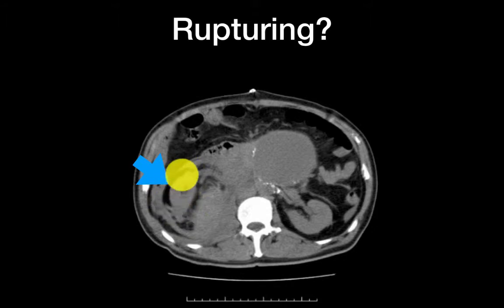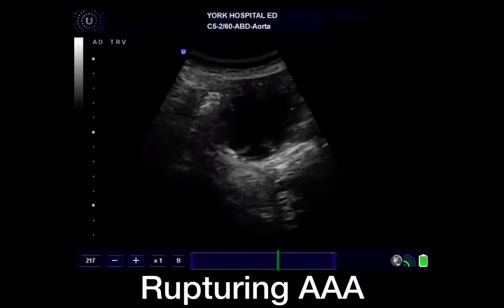this is the right side. You can see right kidney, large right AAA ruptured into that right posterior perirenal space and pushed that right kidney anteriorly. Okay, so again, this can be a tip-off. There's no hard science behind this, but if you're noticing that that kidney is much more anterior than you would expect it to be, it suggests that there's something pushing it up there.